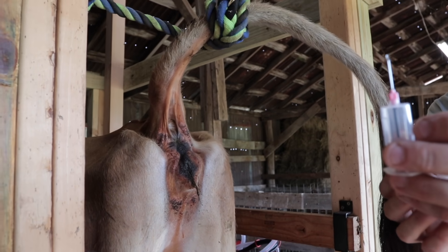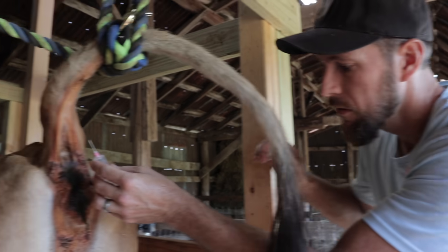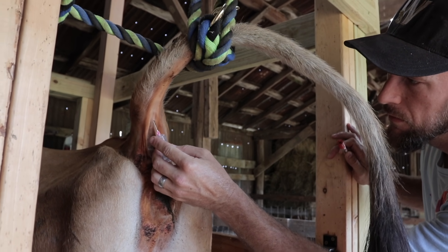We're headed out to milk the cow this morning, and we've also got something else to do. I've got a needle and a tube to draw some blood. We're gonna find out if Dolly, the Jersey milk cow, is pregnant.